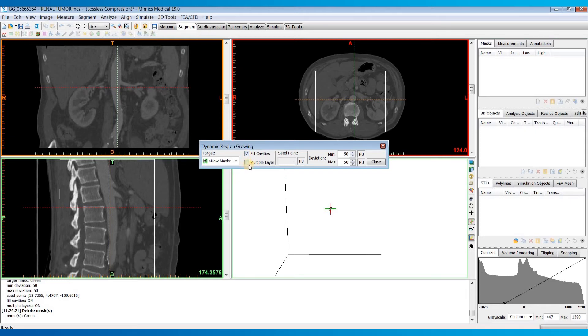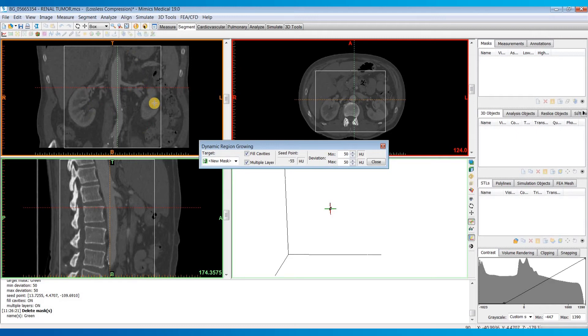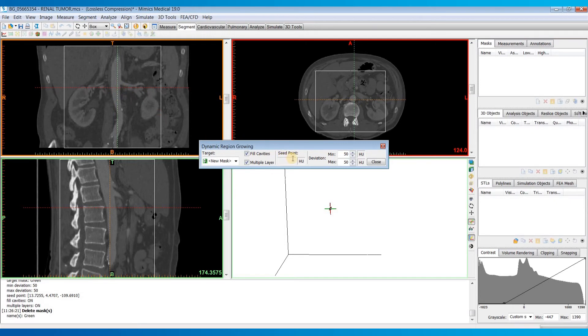And I'm also going to check multiple layers so that it includes all the slices within this cropped region that we selected. And so you can see as I move my cursor around, right here the seed point value is going to change based on what pixel my cursor is currently over.